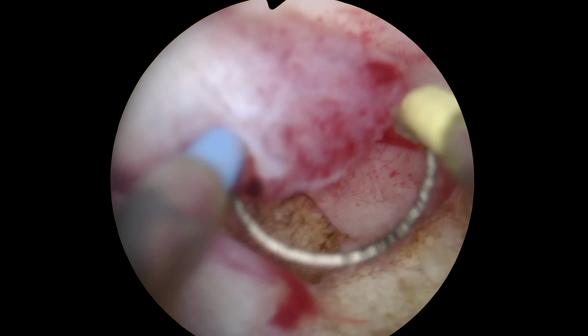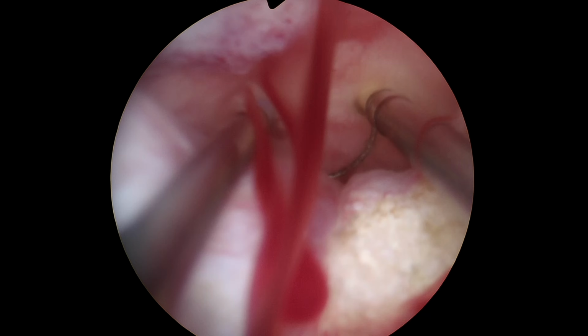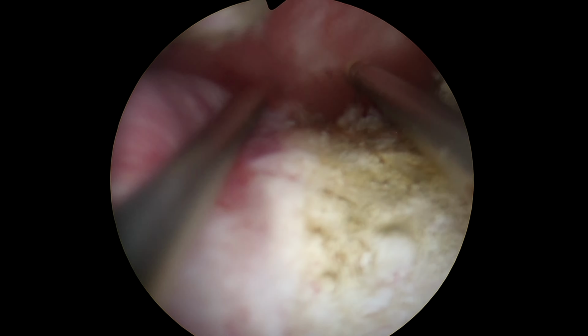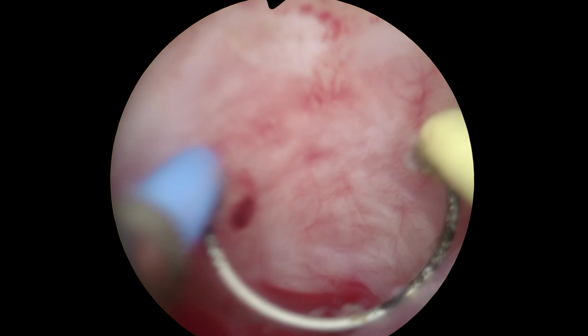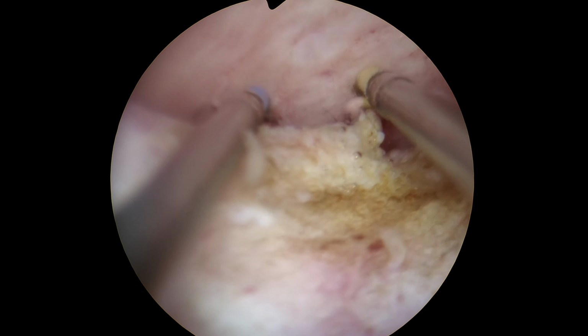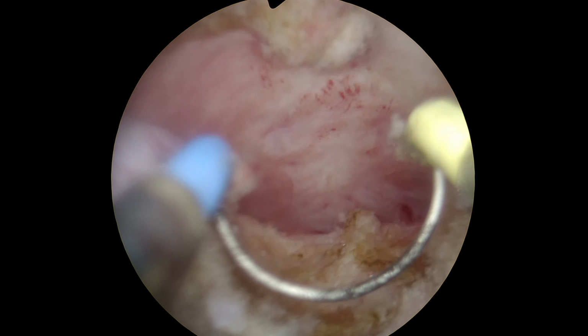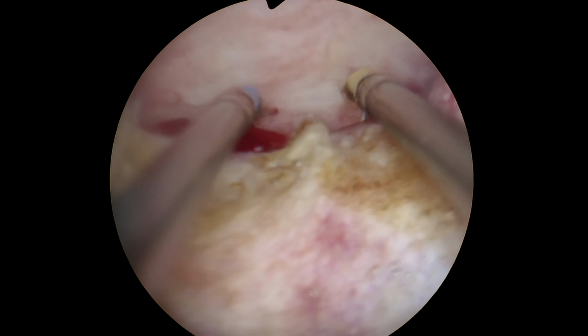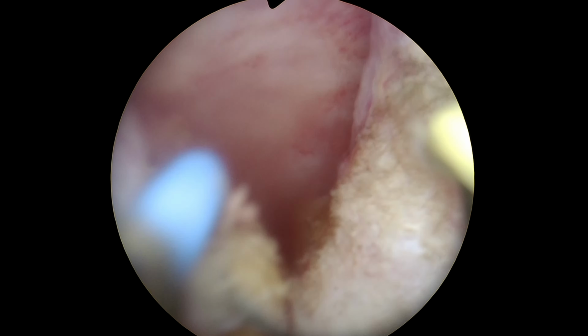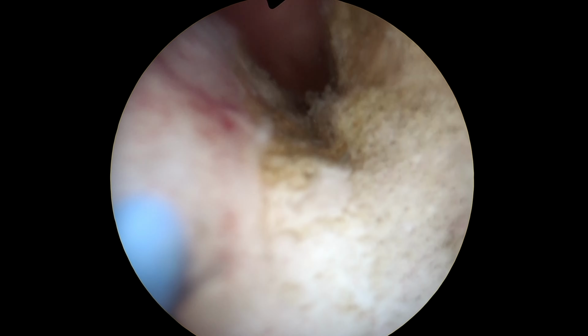Of course, in the literature you can find many wonderful examples and methods, but specifically in this video I want to show you the method that has proven itself from the best side, taking into account our extensive experience in intrauterine surgery. The first thing to understand is the architecture of the uterine cavity. After that, it's necessary to find a proper place to begin the resection.